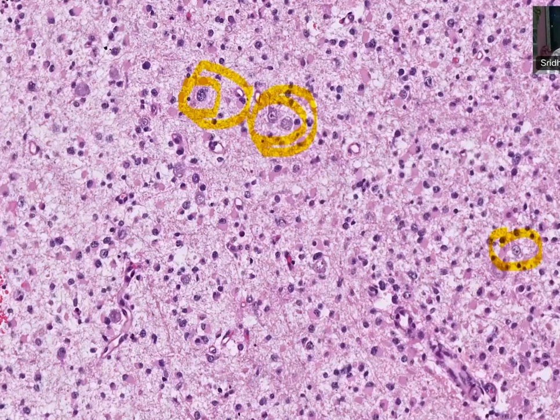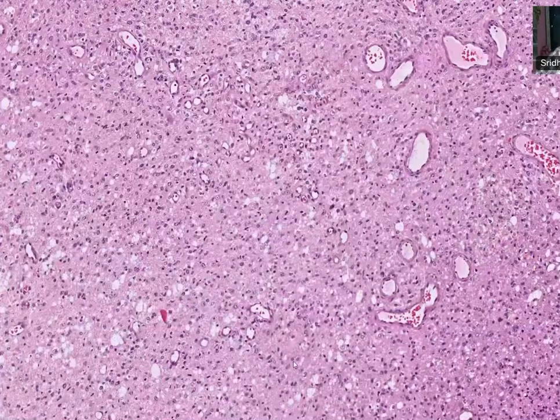Okay, so that's for histological grading. So here, after you see the cellularity and all, you need to comment about mitosis. So what is this field showing? We are not seeing mitosis. You're not seeing mitosis, but are there any additional features in this slide? Vascular. So there is an increased number of vascular channels, right?